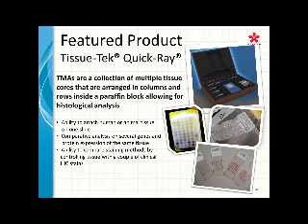Perfect. Another question is, any recommendations for performing IHC on tissue blocks several years old? Again, going back to the stability of the epitopes when something's been paraffin embedded, whenever I do a validation study and I'm bringing in an antibody into my laboratory, generally you go back cases, and sometimes it's 7-8 years.